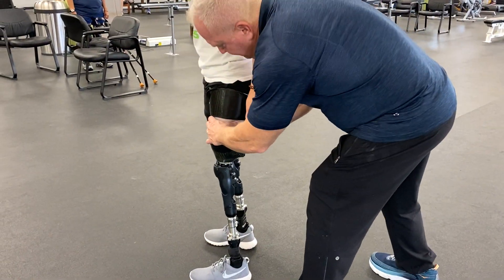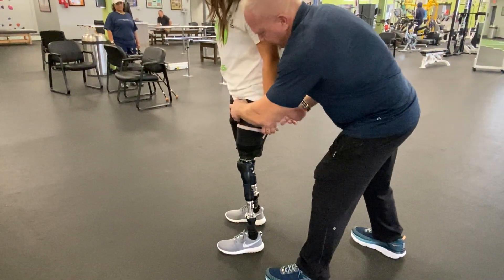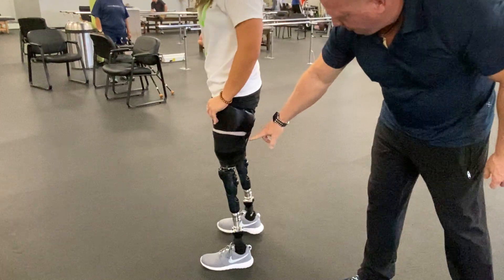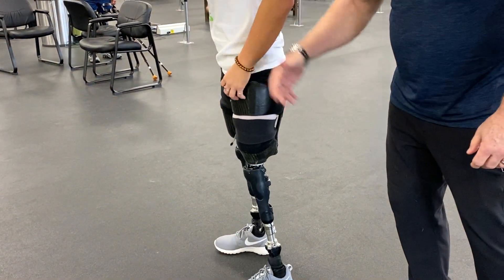So what happens is this allows Ryan's muscles on both sides to fire. Go ahead and bend it here — you can see how that flexes. So as that flexes, this straightens up and allows the push.